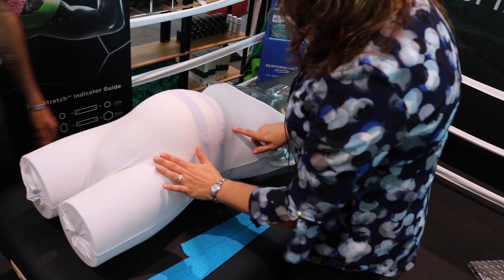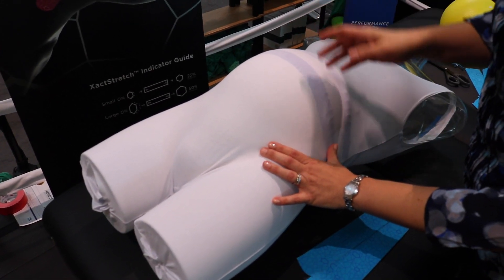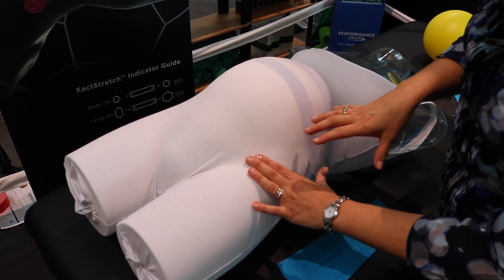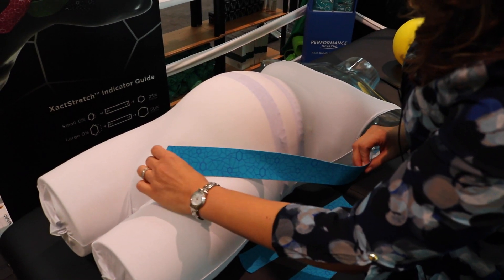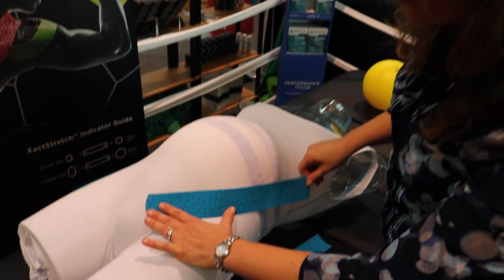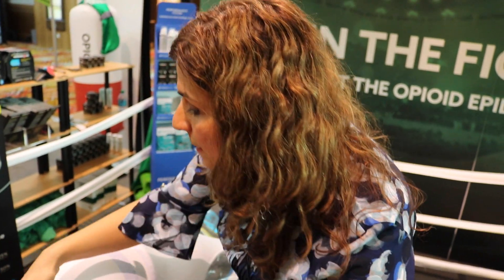I'm going to place two strips along the lateral aspect. After posturally assessing the patient, when we lay them down we look at the location of the round ligament or broad ligament, which is usually very pronounced in pregnant patients. We're going to start at the pubic symphysis and come around the lateral aspect. With pregnant patients, I traditionally start with no tape tension — it's really just to provide support. We'll do it on both sides, then come up the midline to assist with more support for mom.